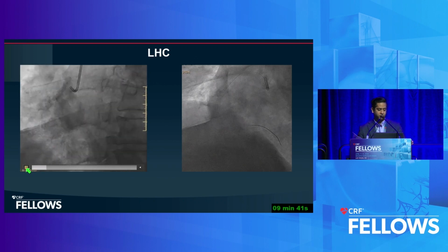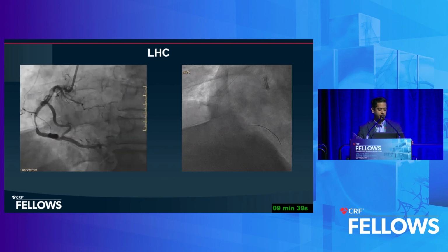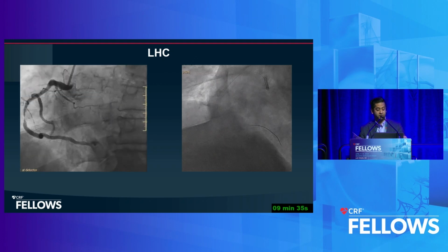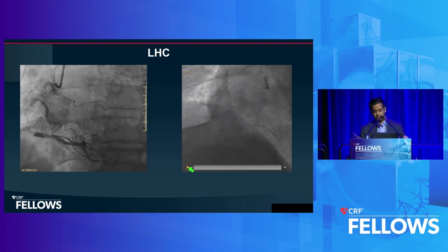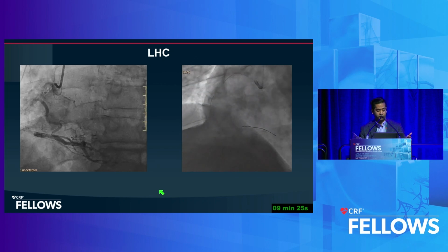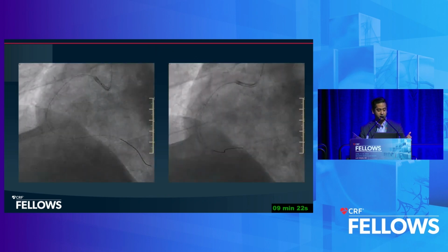And so we took a picture of the right coronary artery, and as you can see, there's that mid-RCA lesion, but it's a very tortuous distal RCA. And so we were actually very easily able to get a Mamba guide wire down, and it really was not a struggle at all. You figured it might be a little difficult getting past that tortuous bend in that distal RCA.